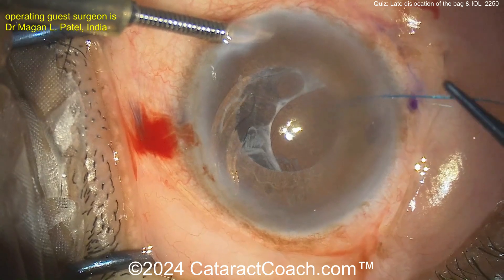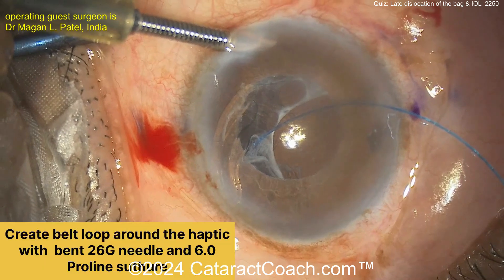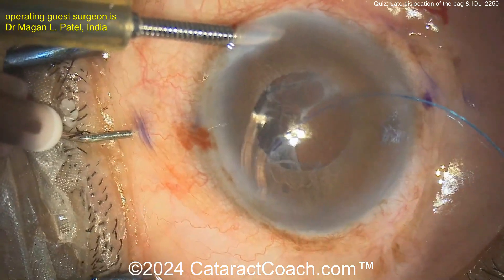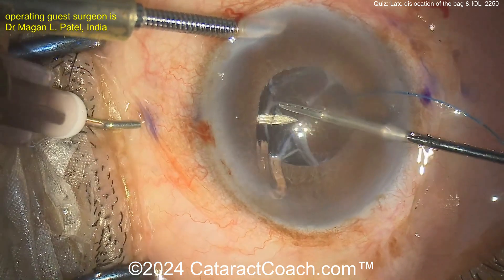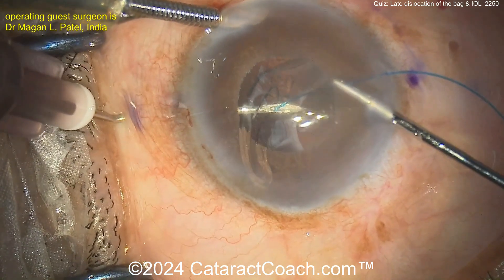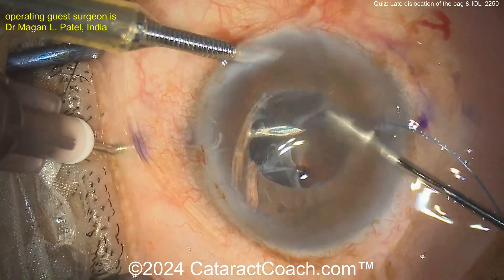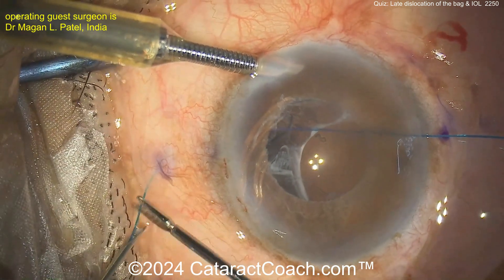You can see the 6-0 polypropylene being threaded through that paracentesis. Now you need to create a belt loop around that haptic. Here's the 26-gauge needle — again using the 6-0 polypropylene or prolene suture — and that needle is coming through here to encase or loop that haptic. It's helpful if the patient has this style IOL where you can see there is an opening in that haptic — it's like a loop, yes the standard C-shape, but also a closed loop.